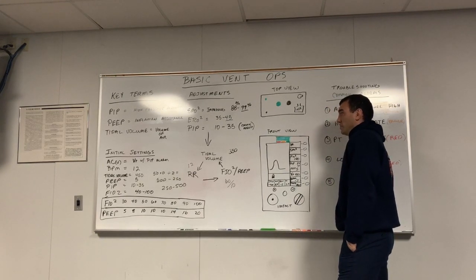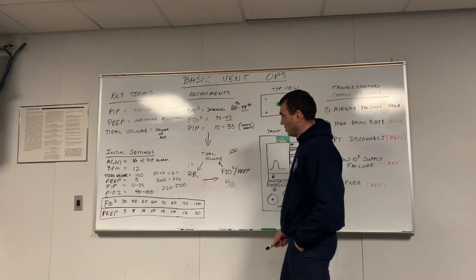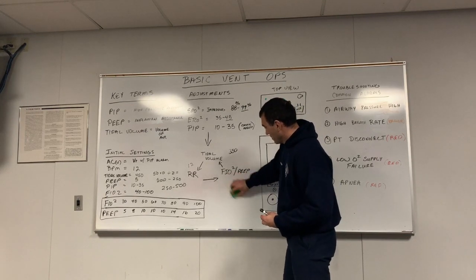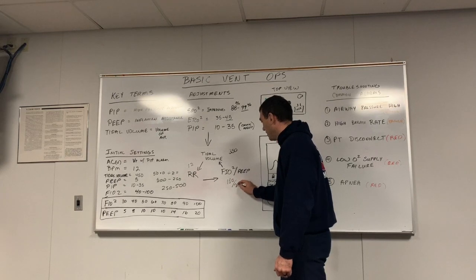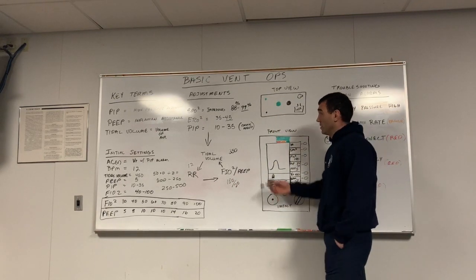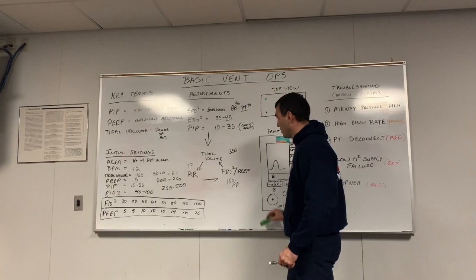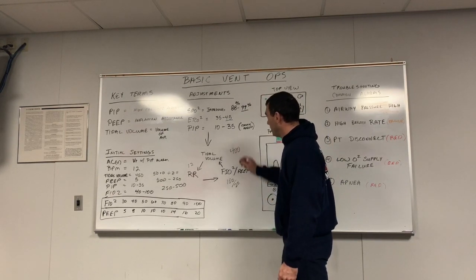Well, it's pretty simple to adjust this ventilator if you understand how these adjustments work in relation to each other. We can run into problems. Let's say we dropped it to 350 and I turned it all the way up to 100 over 20 and I don't have any more options on my FiO2, I'm maxed out. But my patient's SpO2 is dropping, it's not working. I can make another adjustment. Take my tidal volume back to 400. So we go to 400 now.